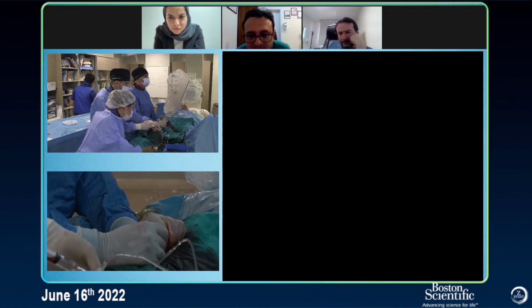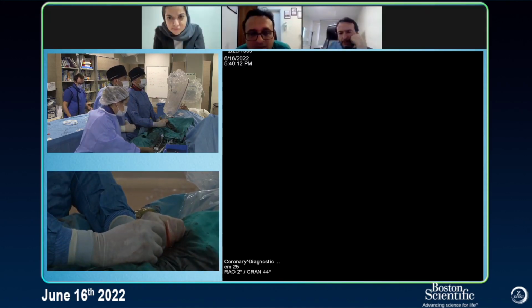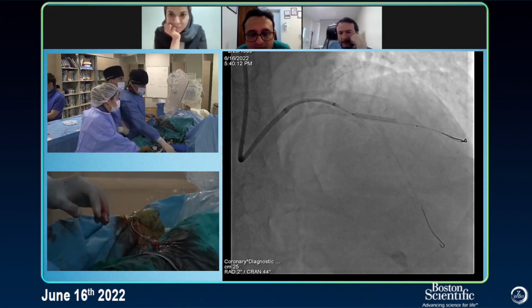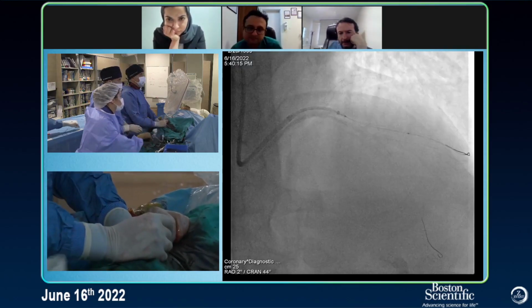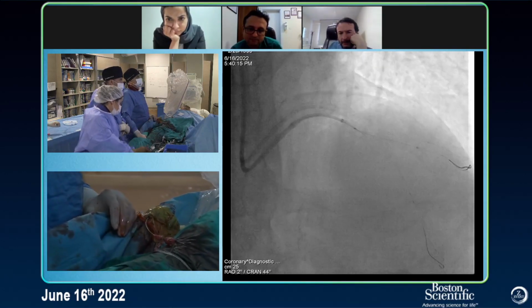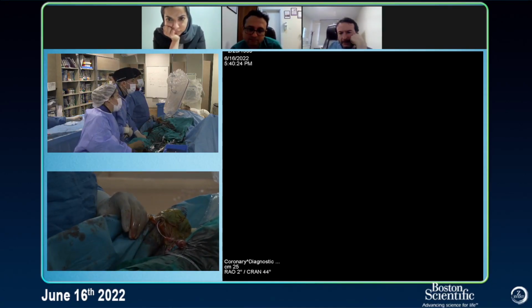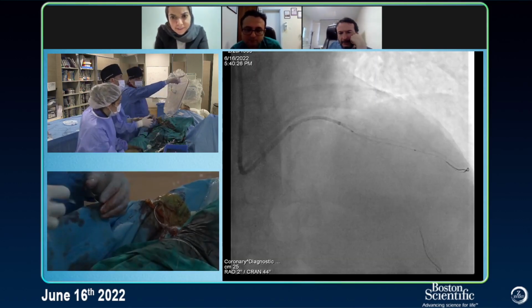Yes. 2, 4, 6, 10, 12. Mini clot. I do mini clot, yeah. So go up more. Okay. Go 18. 18, yes. Yes, good opening. Okay. Show me there.